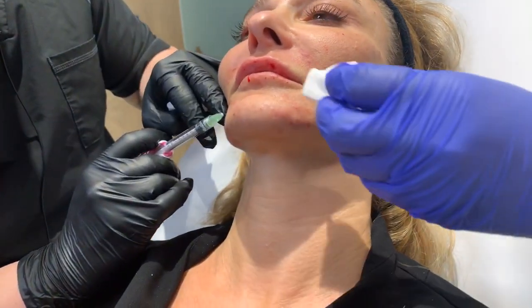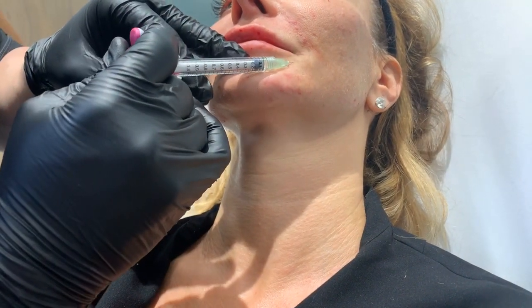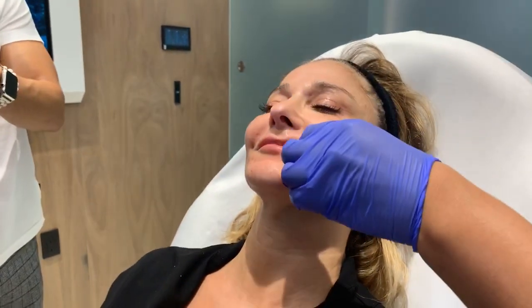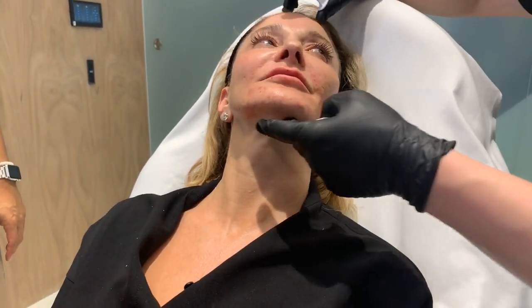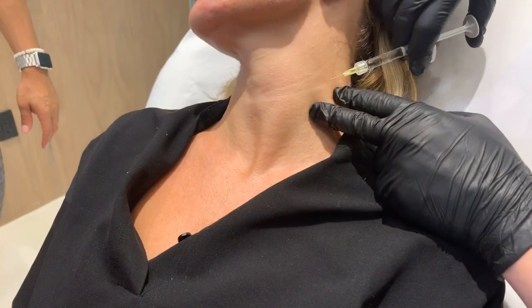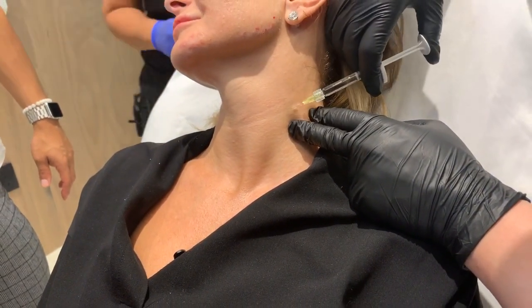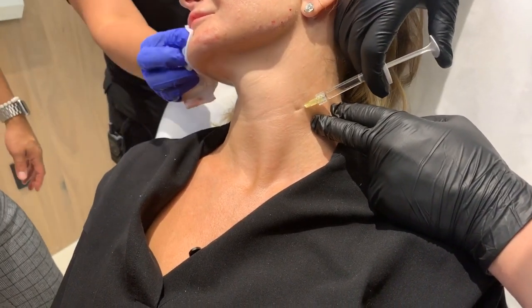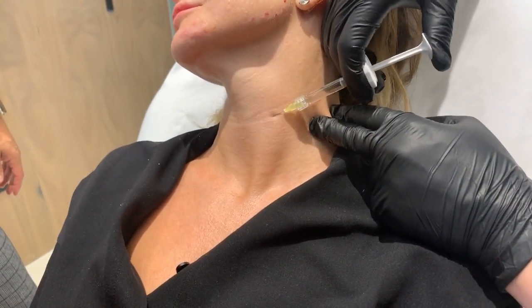Then always good to do just a small amount in the corner. Now, did you numb your neck? Yeah. Okay. So face, as the face is healing, we'll start treating the tech neck. So turn your head a little bit this way. I want to look at those nice lines, okay? You just do little blebs. I call this a string of pearls. Very superficial, little injections, right into there. And then we're going to do a Q-tip technique.